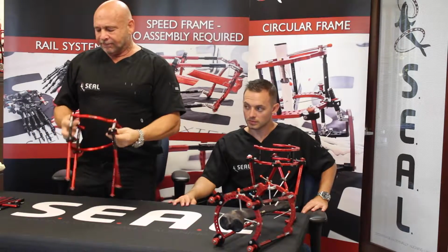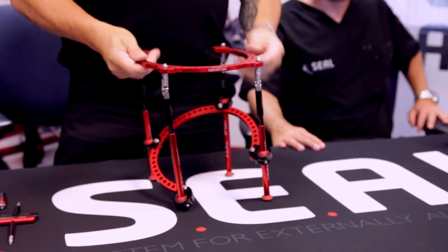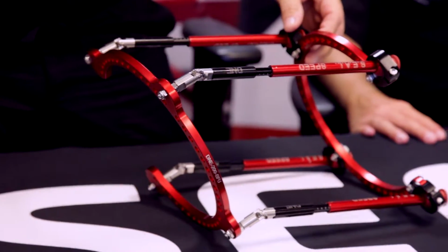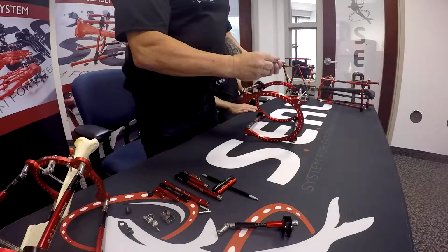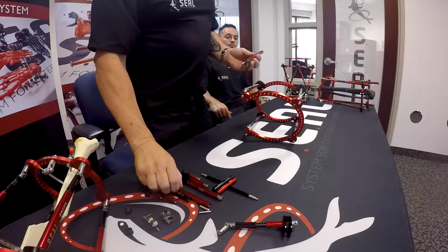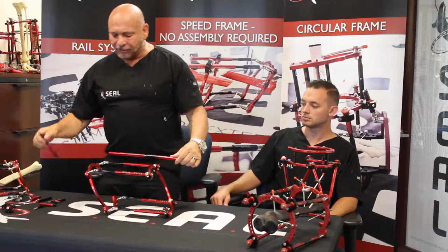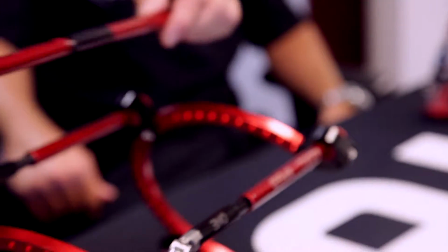So the rings can compress totally onto each other, and they'll distract end to end. You also have the ability to add on to this to make these longer. We have these little threaded rods. These are the speed frame rails. You merely have to thread in the threaded rod and any length spacer, and you can grow these rails as long as you want, and you can keep adding. You can add another rail on it if you want the ability to compress and distract in certain areas.